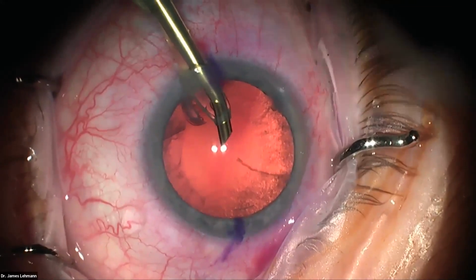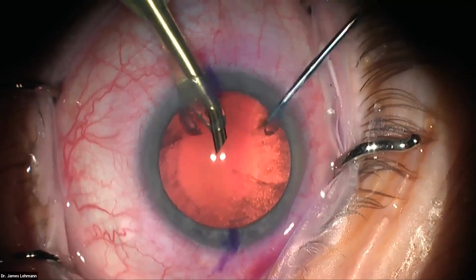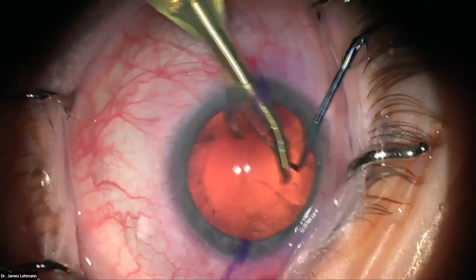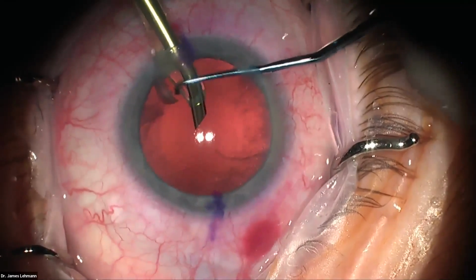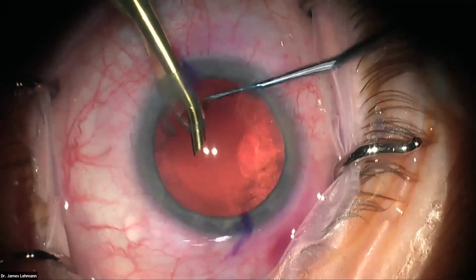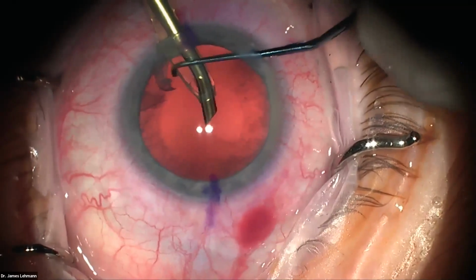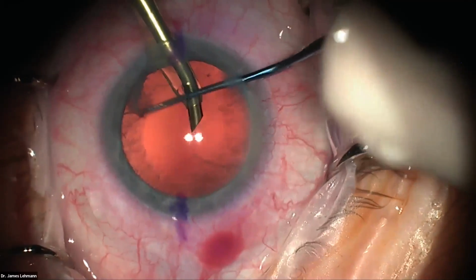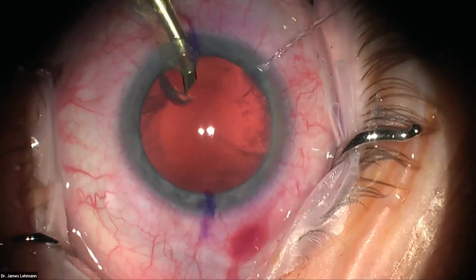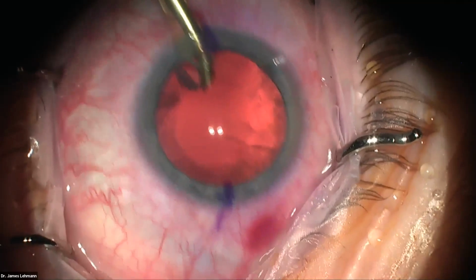So that one's right there. That one I should be able to eat with the I/A, but I'm going to just show you how to get a piece like that. So first we'll get that one. Now here what you do is you lower your phaco tip and put your second, or now I'll raise it. Nope, lower. And just move that second instrument around and kind of swing it around. So it wants to keep coming there because there's some outflow there. So I'm just going to remove the phaco tip and I'll take it with the I/A.